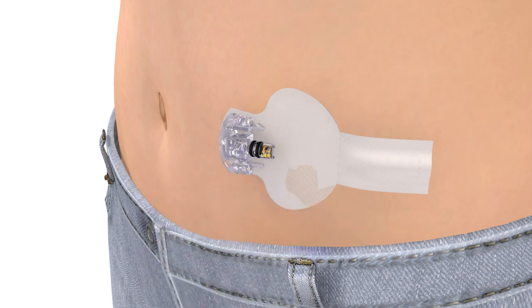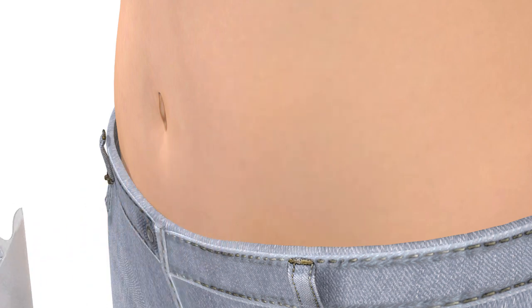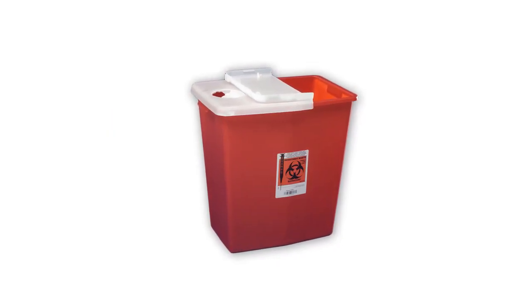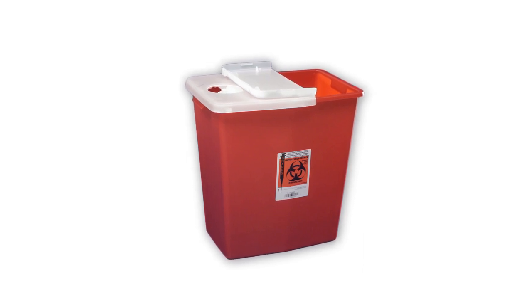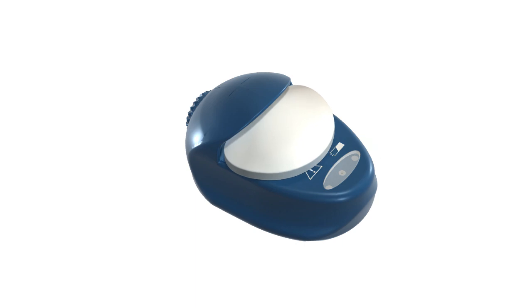Next, loosen the sensor adhesive by lifting up the adhesive tab. Remove the sensor from your body and discard it in a sharps container. Be sure to follow the instructions in the Minilink User Guide on how to properly clean your transmitter. Then, place the transmitter back on the charger so it can recharge.